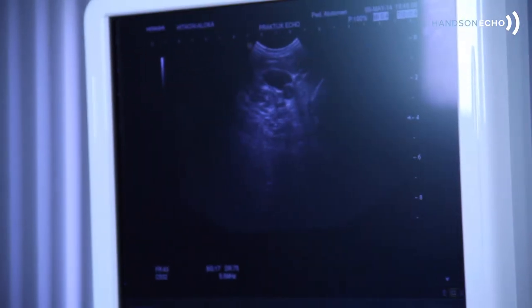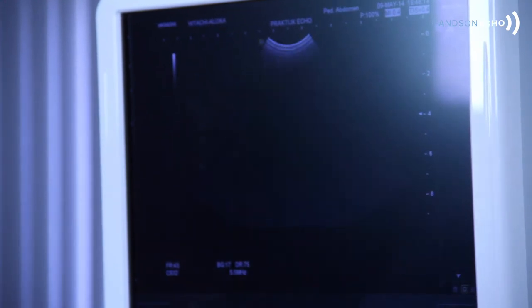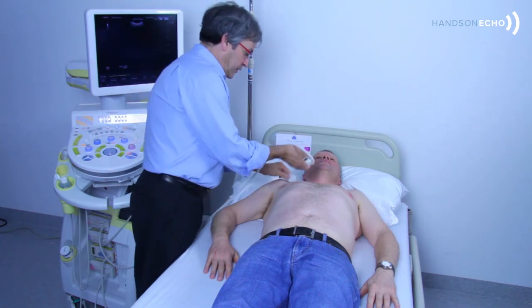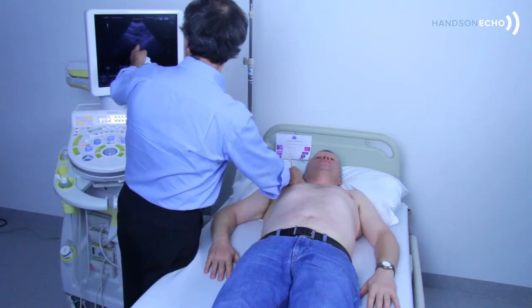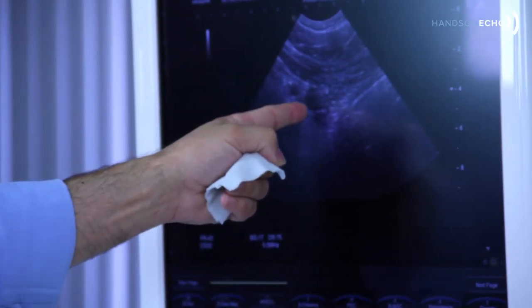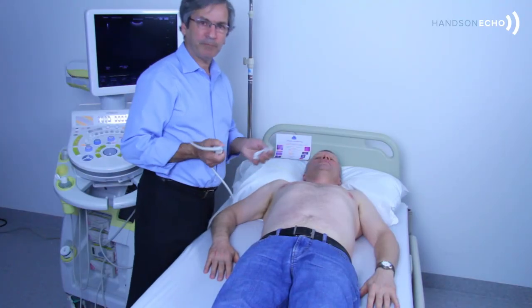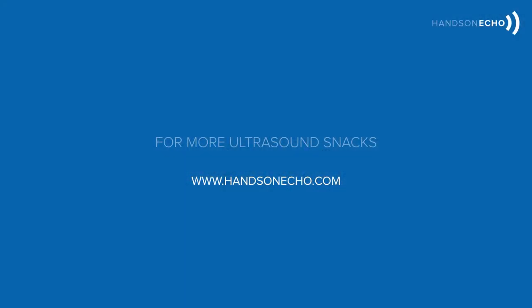You can see that this probe is not a vascular probe, but you can insert it here — even at the subclavian vein — and perfectly visualize all the venous network. You can see the subclavian vein and the pleural line, and notice how near they are. This is a probe you can apply everywhere, including the optic nerve, abdomen, and heart.